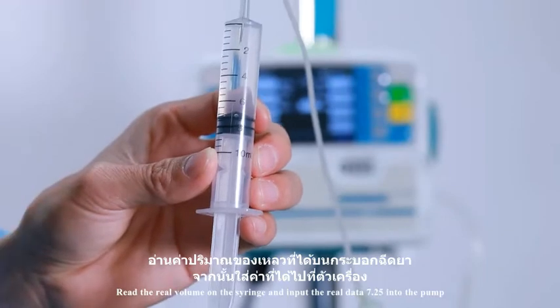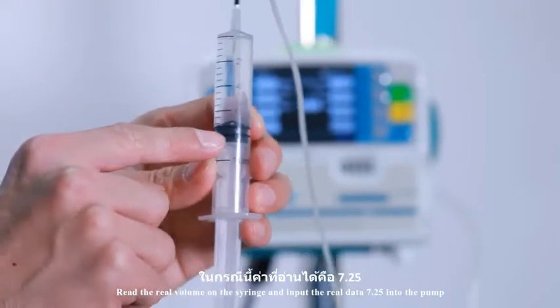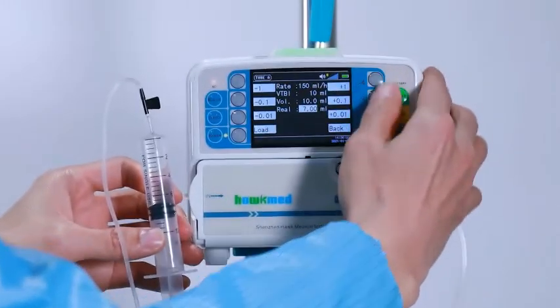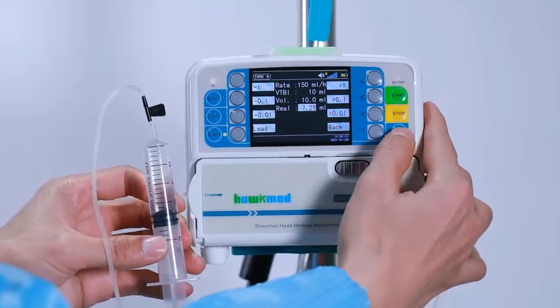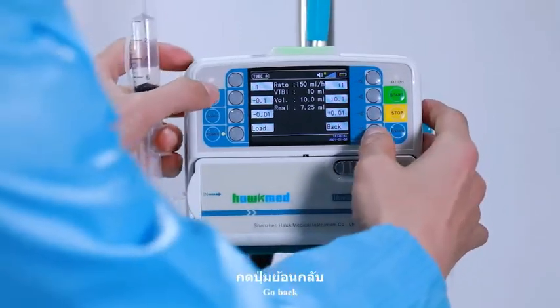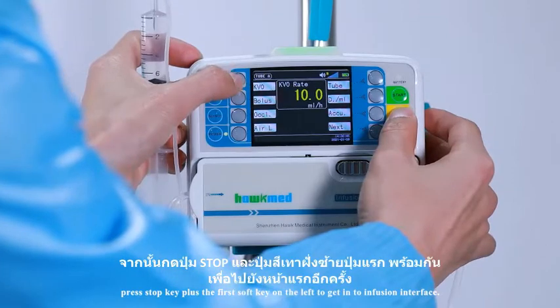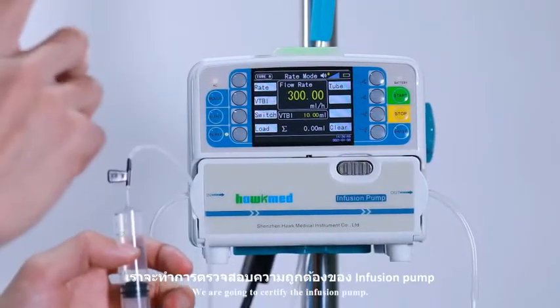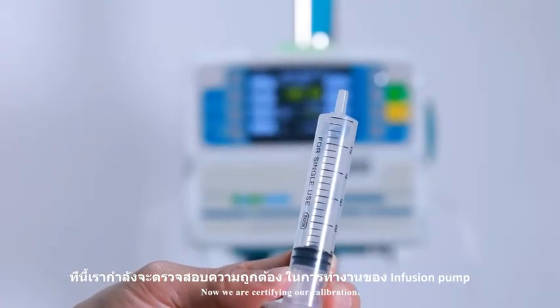Read the real volume on the syringe and input the real data — for example, 7.25 — into the pump. Press enter. Go back. Press stop key plus the first soft key on the left to get into the infusion interface. We are going to certify the infusion pump. Now we are certifying our calibration.